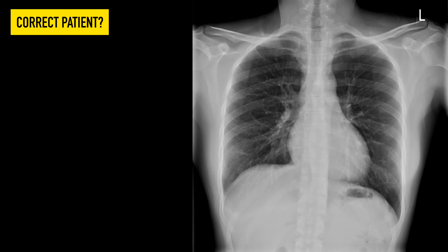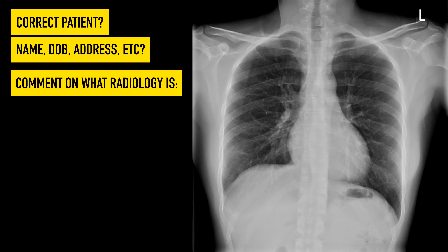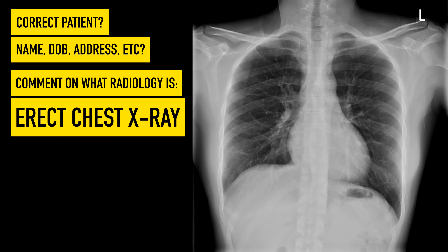So Adam, we've got a chest X-ray up here. Walk me through how we're going to assess this and how we can talk about what we can see to a senior. The first and perhaps most important thing is confirming it's the correct patient X-ray. Is it the right name? Is it the right date of birth? Is it the right hospital number? You get patients with the same name and date of birth, but they really shouldn't have the same identifying numbers in your admin. Once we're certain we're looking at the right X-ray, have we got the right body part?